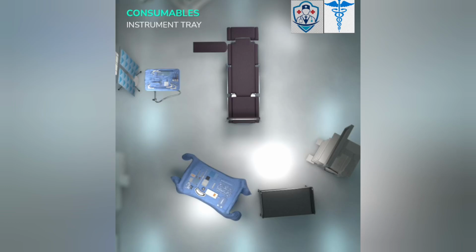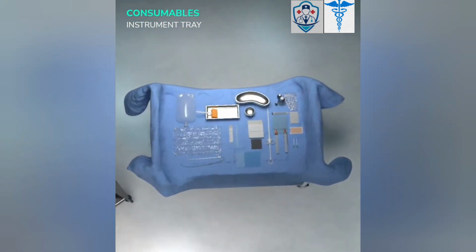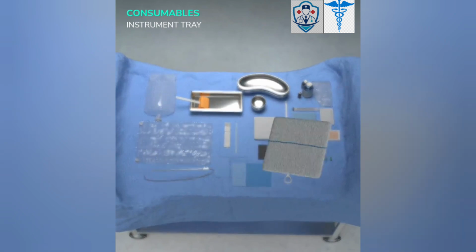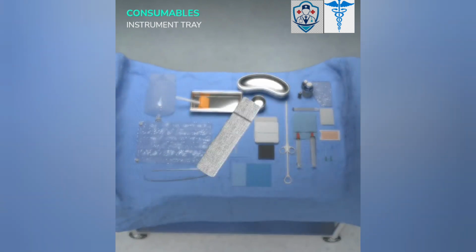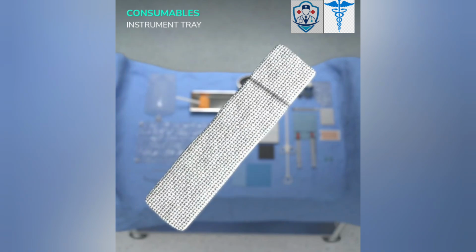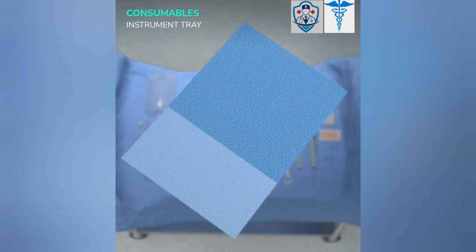This simulation introduces the surgical set used in a standard laparoscopic appendectomy. The 10 by 10 centimeters gauze swabs can be used to control bleeding. The tonsil swabs can be used to facilitate hemostasis. Any discarded sharps should be placed in sharps pad.